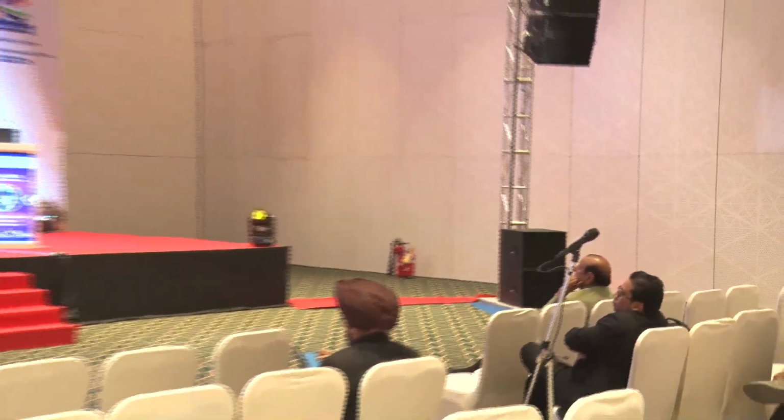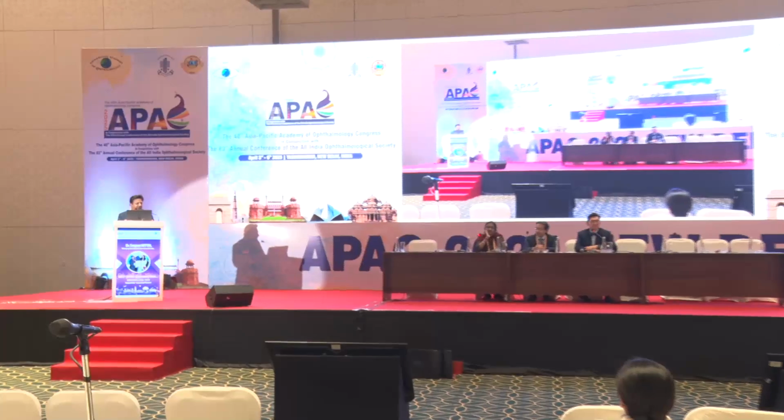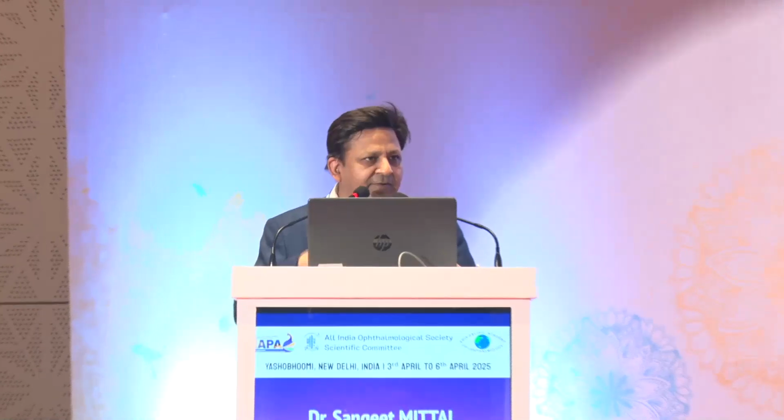I think it is situational, it depends from situation to situation. If you are able to repair the older tunnel which has already been made, I think that will be the best procedure. But if not, if you still think that there is a problem, then you can shift to another tunnel. So I had done one case in which there was a clear corneal incision which had been done for cataract surgery, and there was a problem, and we can't do this.